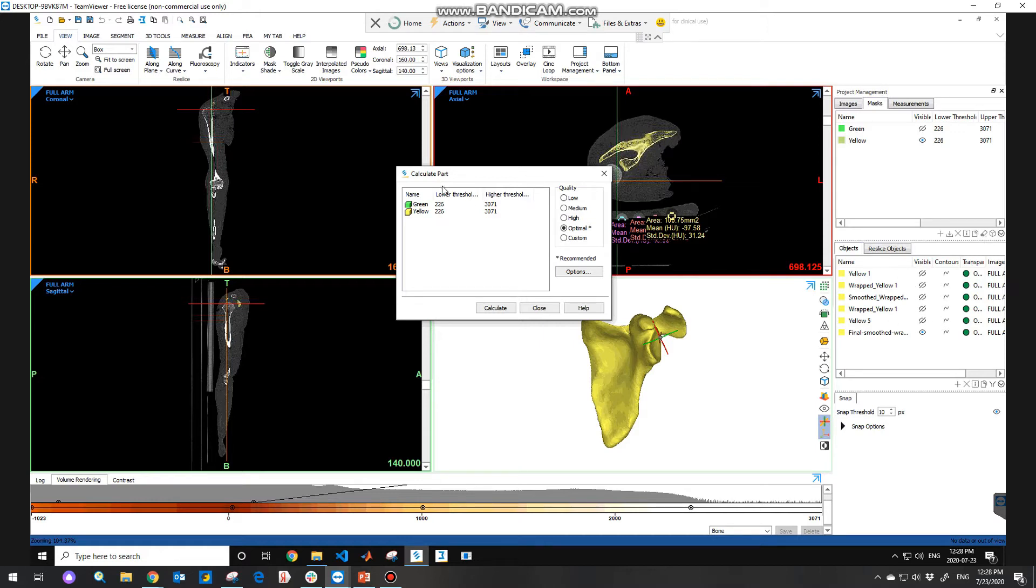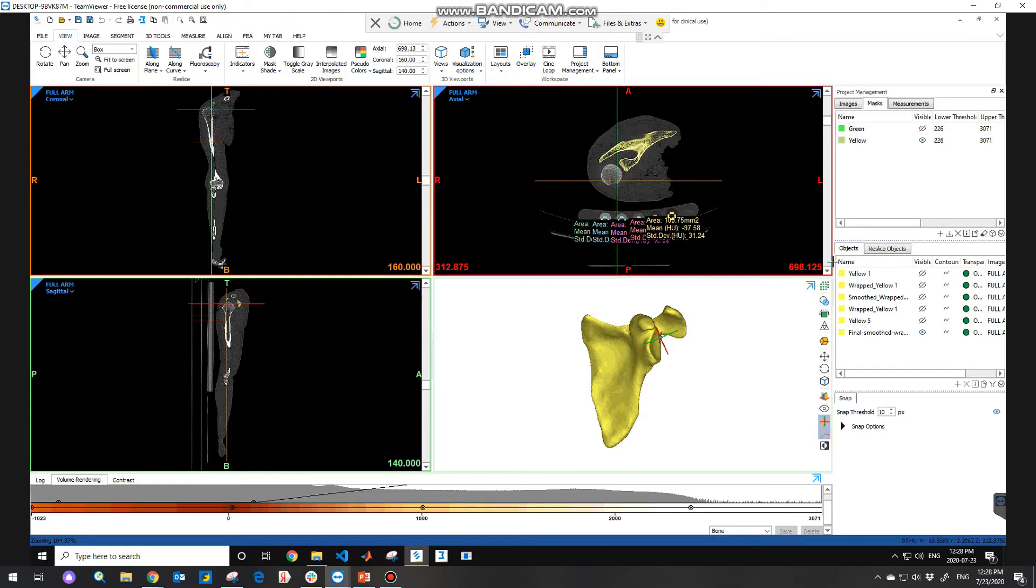So in the calculate part, usually you need to choose optimal as a quality and then hit calculate. Also, if you want to import a mesh model into Mimics, you need to paste the model in here.